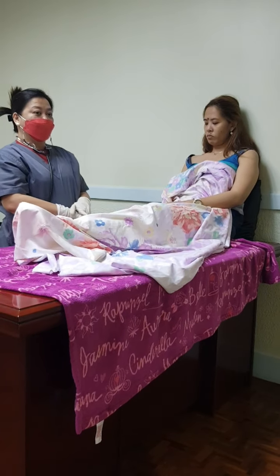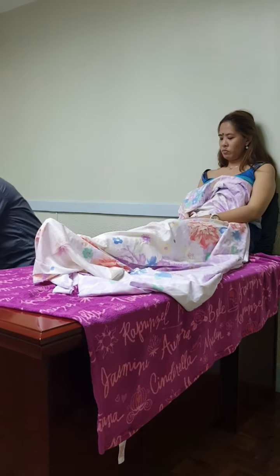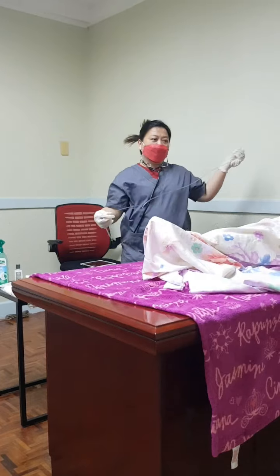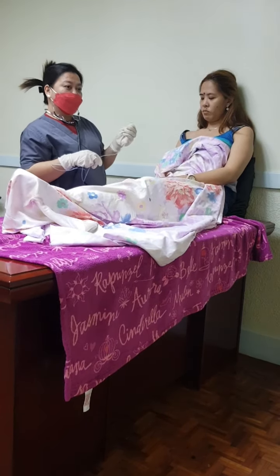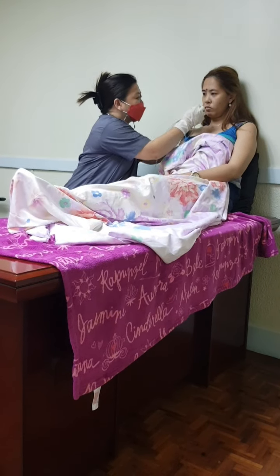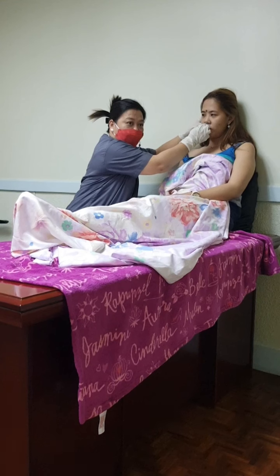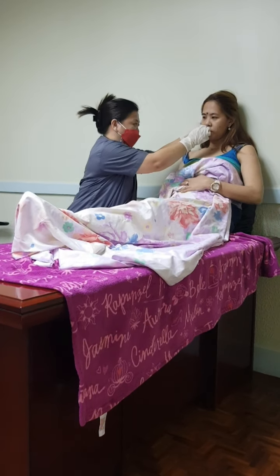Measure the distance to insert the tube by placing the tip of the tube at the client's nostril, extending it to the tip of the earlobe, then extending it to the tip of the xiphoid process.